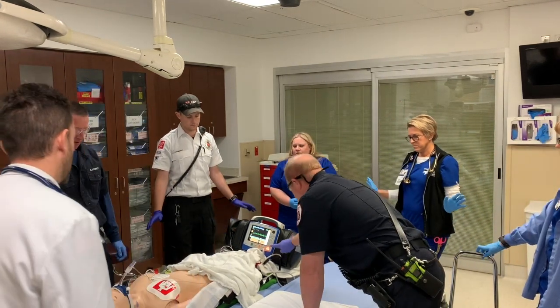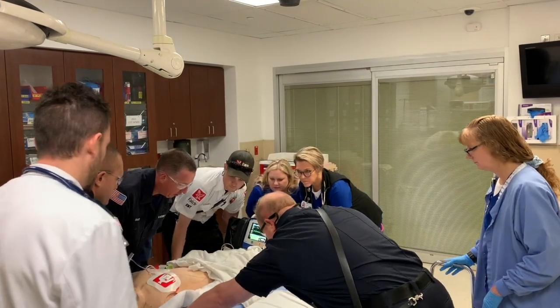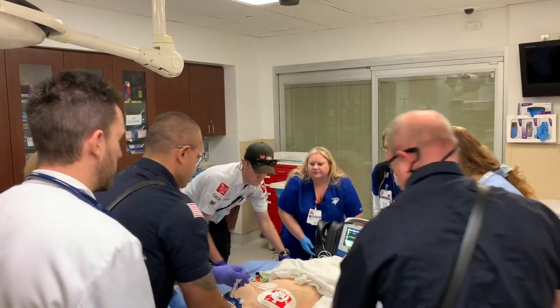Okay, I'm clear, everyone's clear. Shock delivered. 1, 2, 3. New compressions.